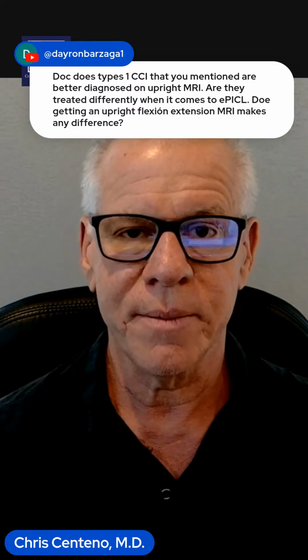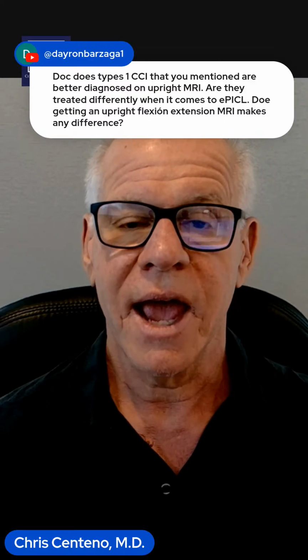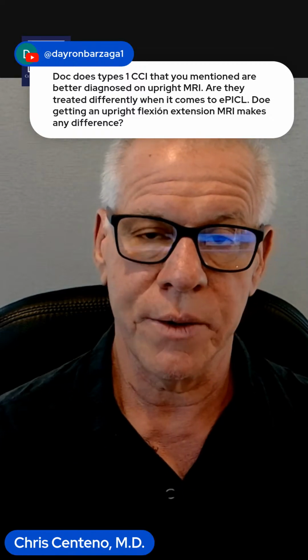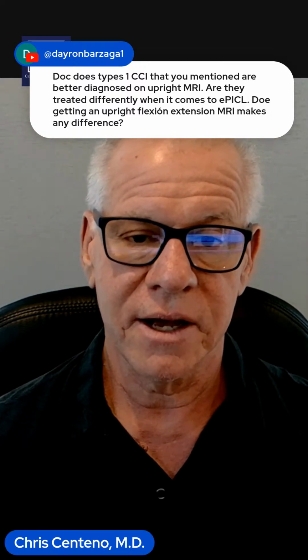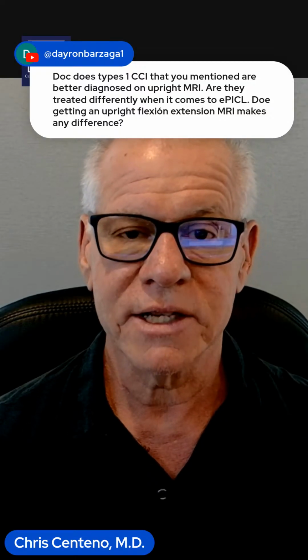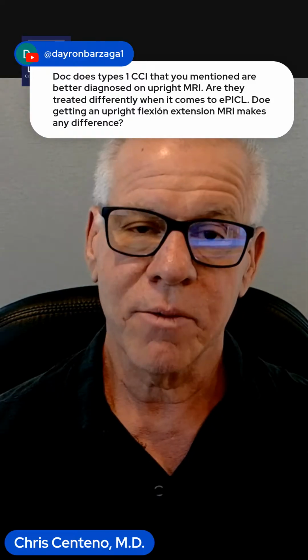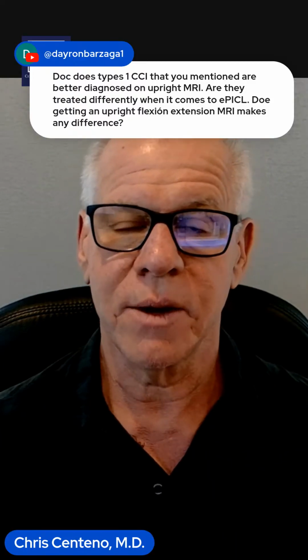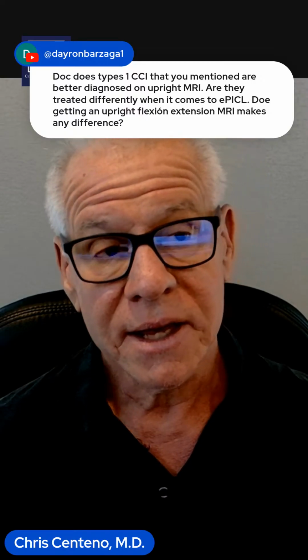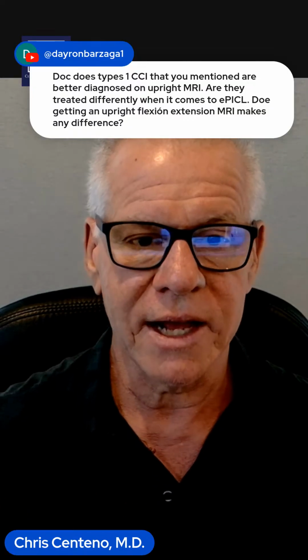And I'm hedging on that a little bit because there are times an upright MRI can show some really interesting things. And there are times that we'll recommend someone get an upright MRI when the DMX isn't clear or it's showing some suggestion of issues at 0-1. But just realize that if you have a DMX showing instability, you can certainly get an upright MRI, but we're trying to get over that hump of whether or not someone's an EPICL candidate, and getting the upright MRI may or may not change what we're doing, because oftentimes we're treating at 0-1 anyway.